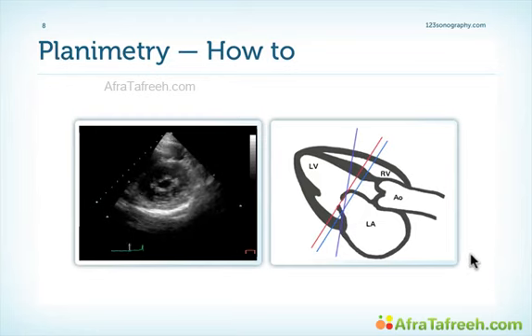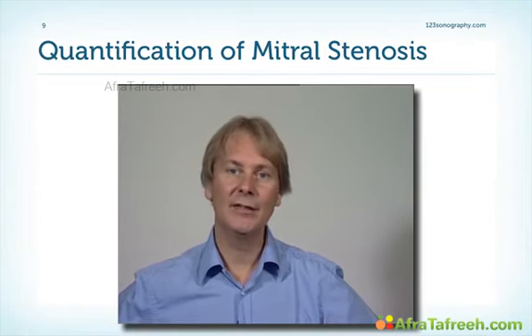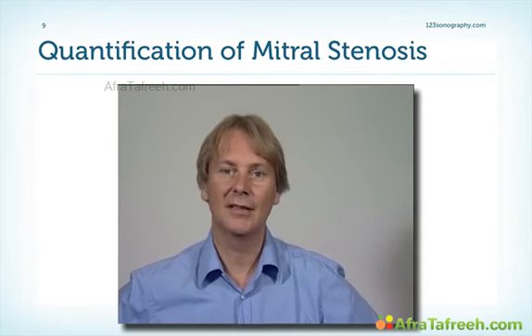If I want to see if a student is good at echocardiography, what I let them do is quantify the severity of pulmonary hypertension, in other words, get the TR signal. And the other thing I let them do is planimetry of the mitral valve. Why? Because both of these things are very difficult. Here's a demonstration which shows you why it is difficult.